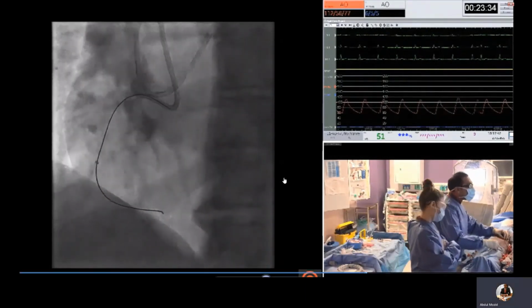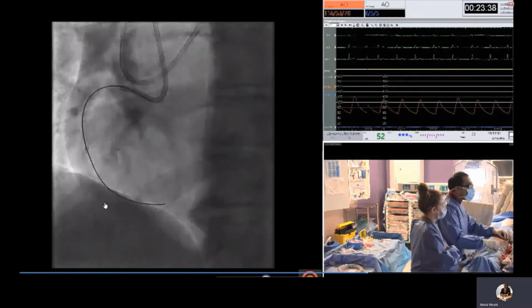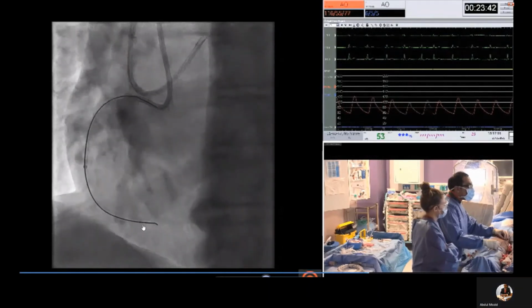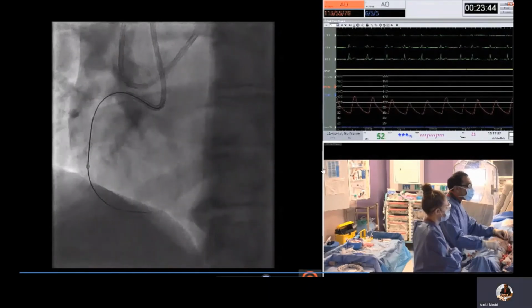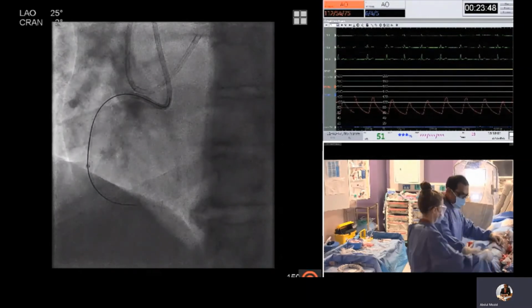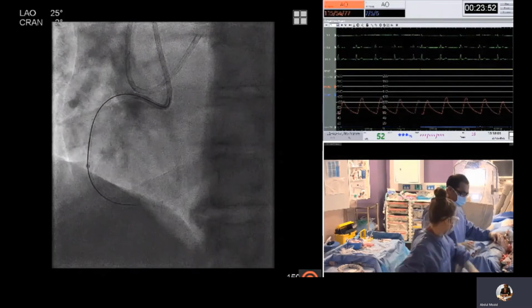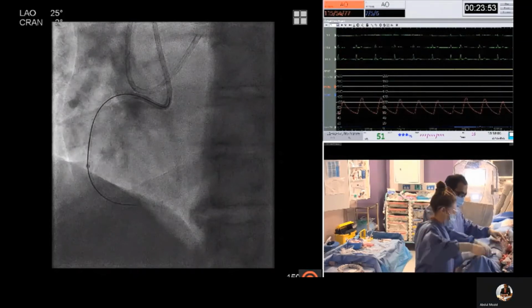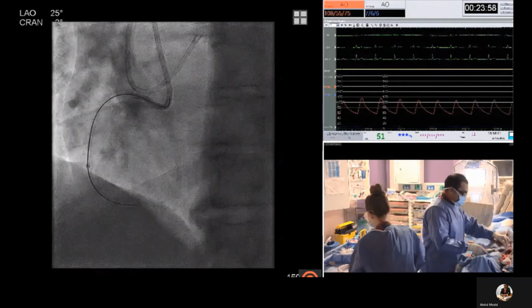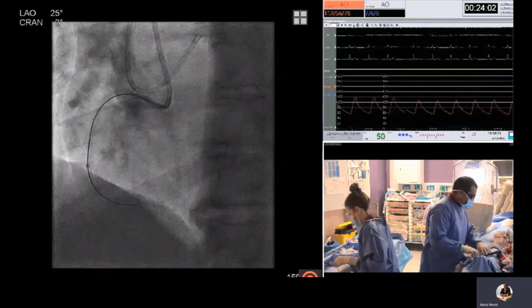As you can see here, two dots of the Stingray coming down just here. So the Stingray is now delivered, and this is again a much easier process having a Trapliner in the vessel, as you can deliver and trap off the devices fairly easily.